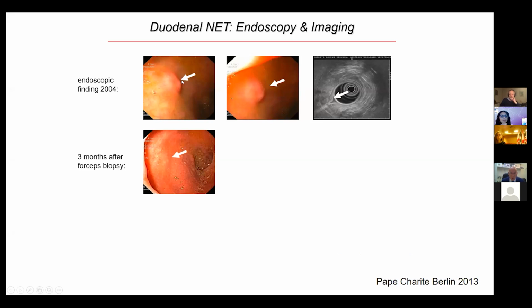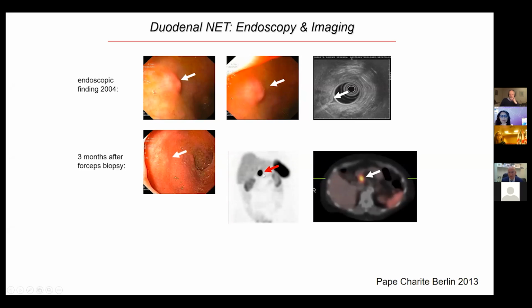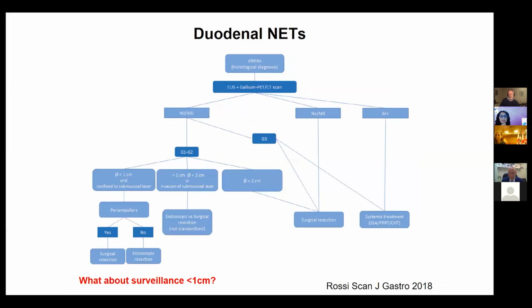This is a small duodenal polyp, and ordinarily you might often just keep that under review. This is an endoscopic ultrasound showing the invasion of this polyp. And in fact, this polyp had local lymph node involvement. So this patient did go to the surgeon and had a gastrinoma which was causing problems, and the primary and the lymph node were resected.